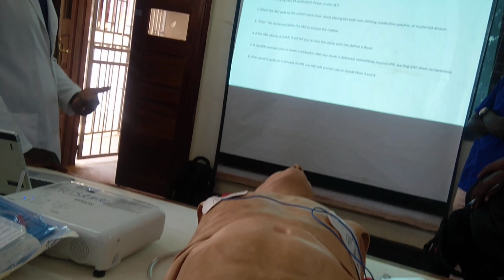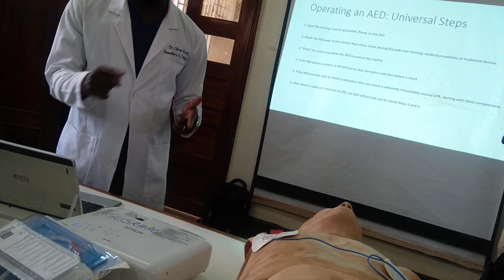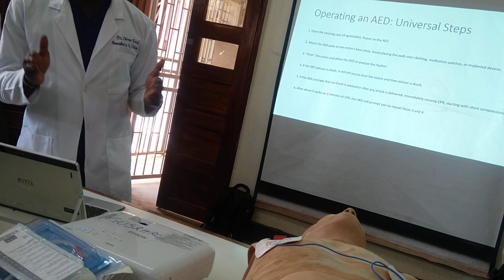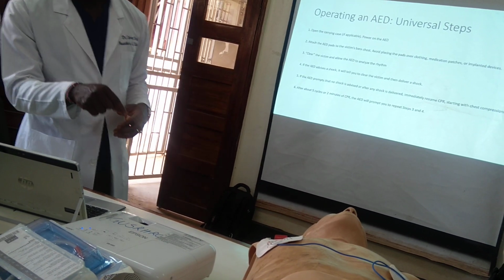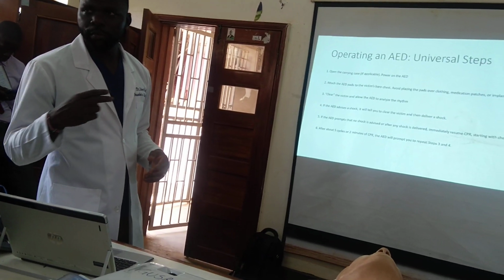Those who are doing chest compression, you have been told to clear. Okay, insert new cartridge. Deliver shock. Shock has been delivered. Within 2 seconds, you must be back on chest compression. And the cycle goes again for another 2 minutes.